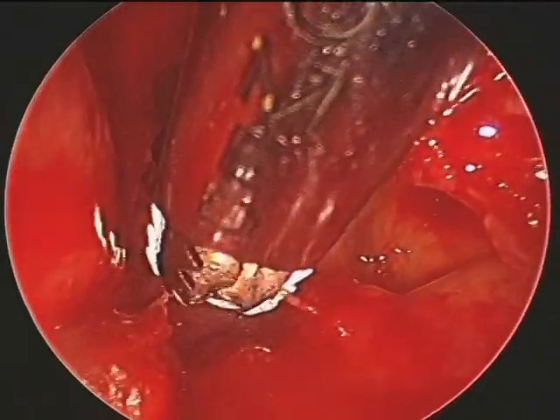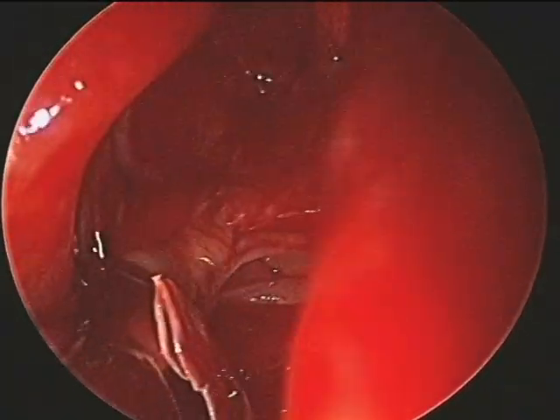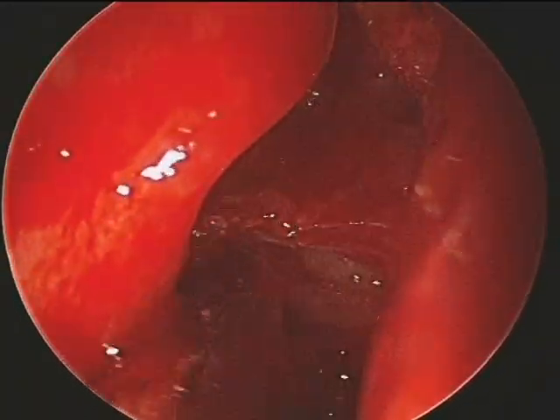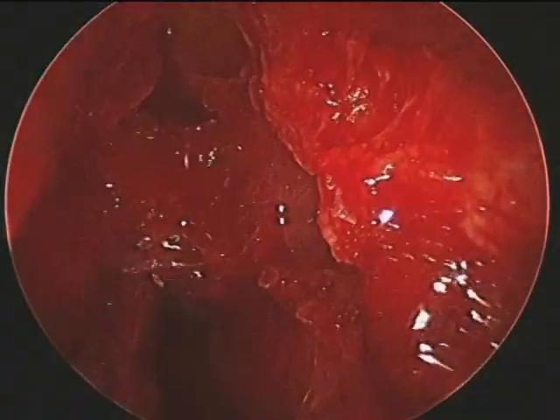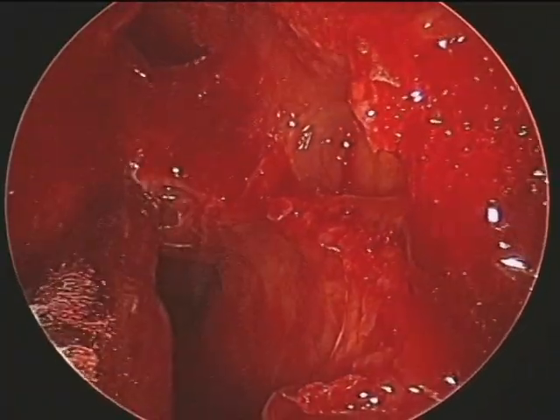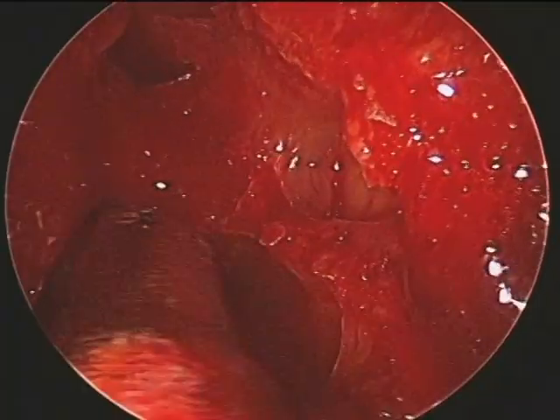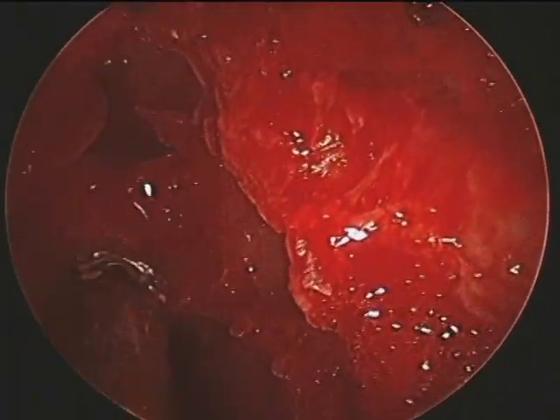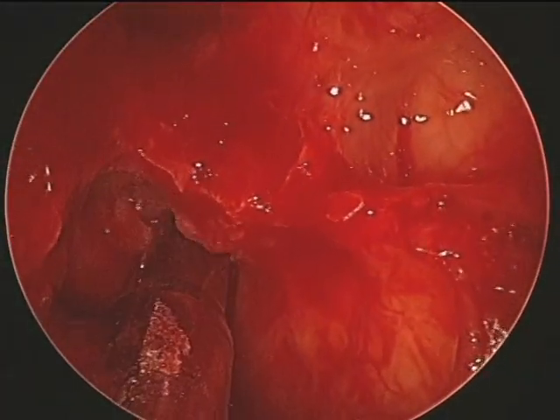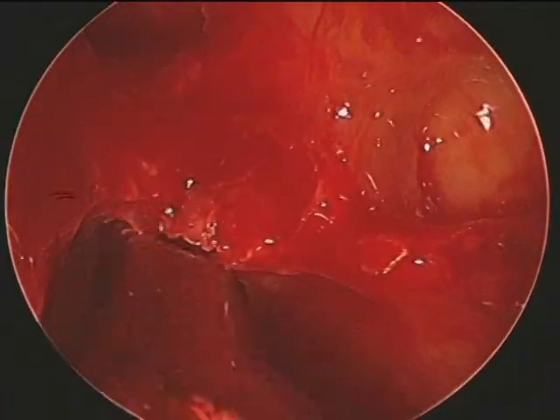That is the vertical attachment of the bulla ethmoidalis to the skull base. We use a RAD 120 blade to further explore the anterior fovea. You can see the edematous mucosa in the area of the attachment of the bulla ethmoidalis to the skull base — you need a lot of caution here, preferably ensuring adequate hemostasis, so as not to cause injury to the skull base with inadvertent leakage of cerebrospinal fluid. We cautiously divide that area, keep debriding gradually, and that is the skull base.